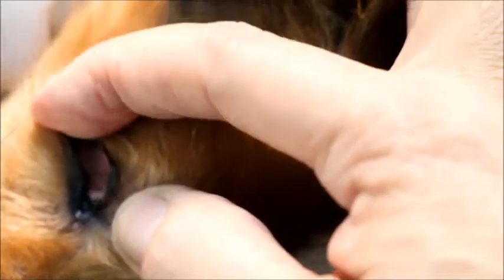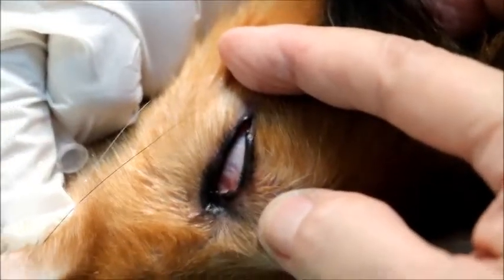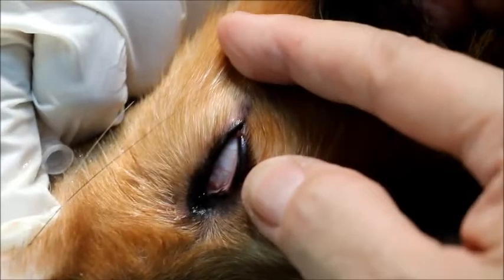0.5% at 10:54 p.m. Very bad breath, yeah. Let's see the eyes. The eyeball has rotated downwards. Even at 0.5%, this shows that the sedation has been effective. So the minimum anesthetic, the better. Although normal maintenance is 2%, now we are doing it at 0.5%.